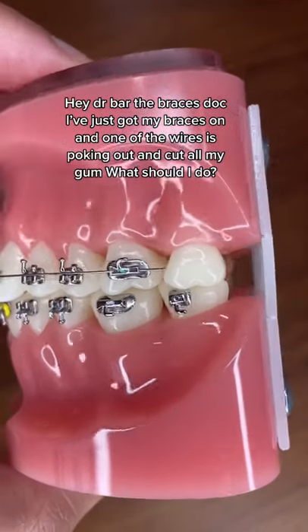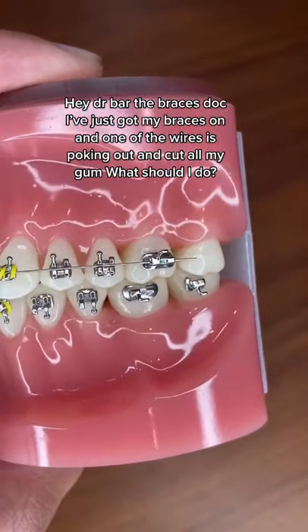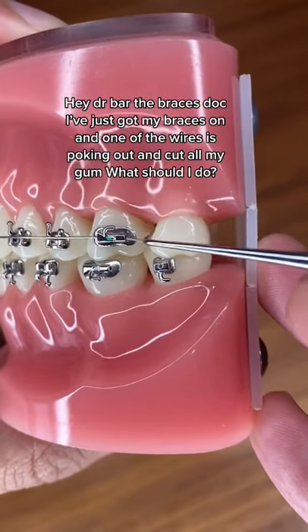Hey Dr. Bar, the braces doc — I've just got my braces on and one of the wires is poking out and cutting all my gum. What should I do? That's a great question and there are three things you should do.